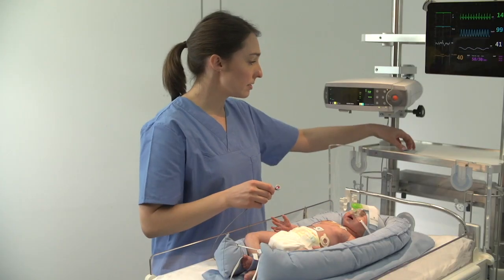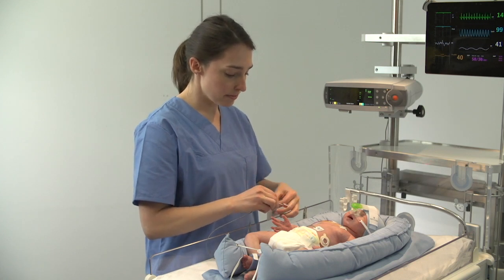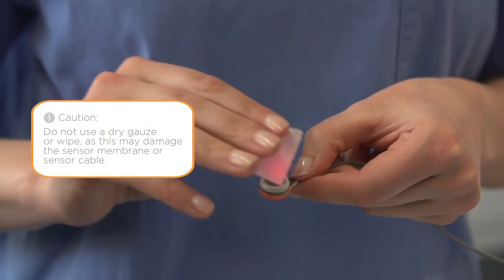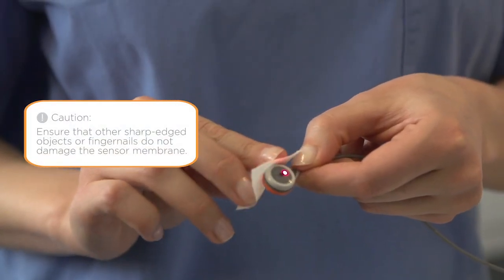To clean the sensor, use a lint-free gauze soaked in 70% isopropanol or other approved cleaning agent. First, gently wipe the surface of the membrane. Do not apply pressure or scrub the membrane surface. Then, clean the outer rim and sides of the sensor.